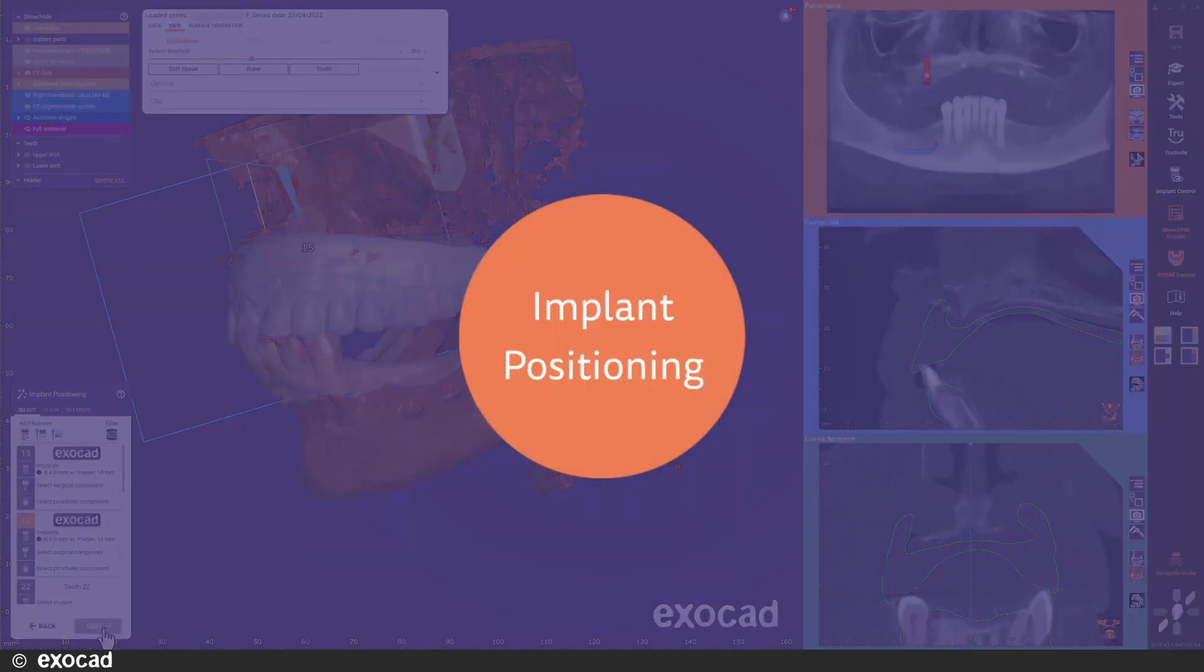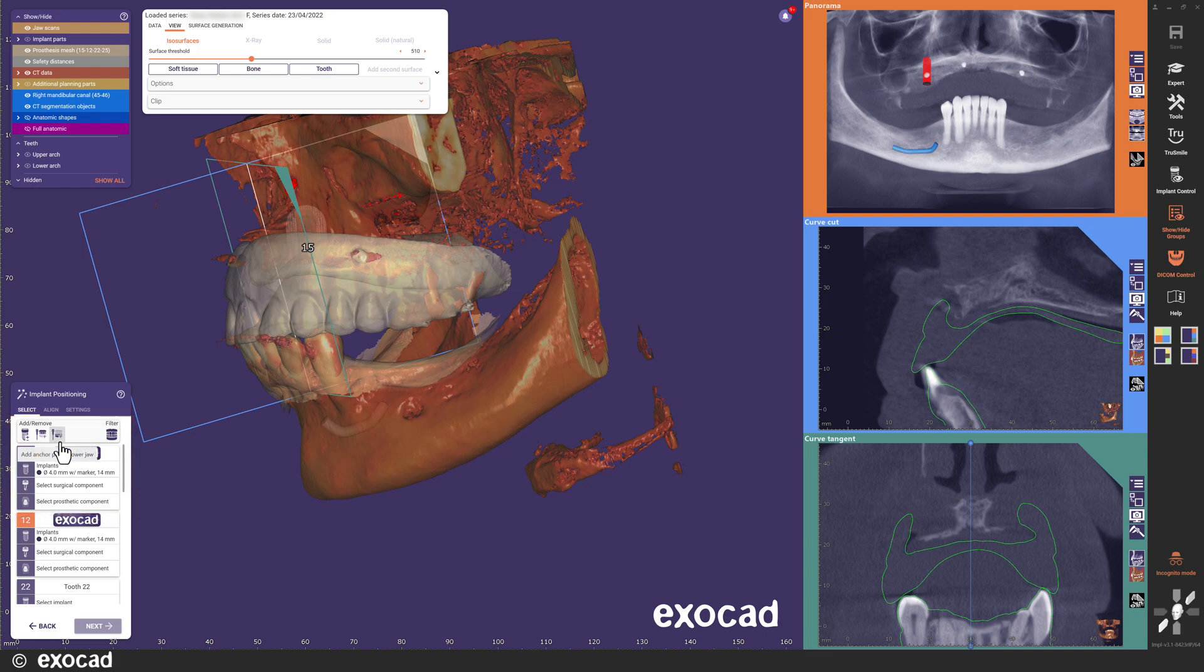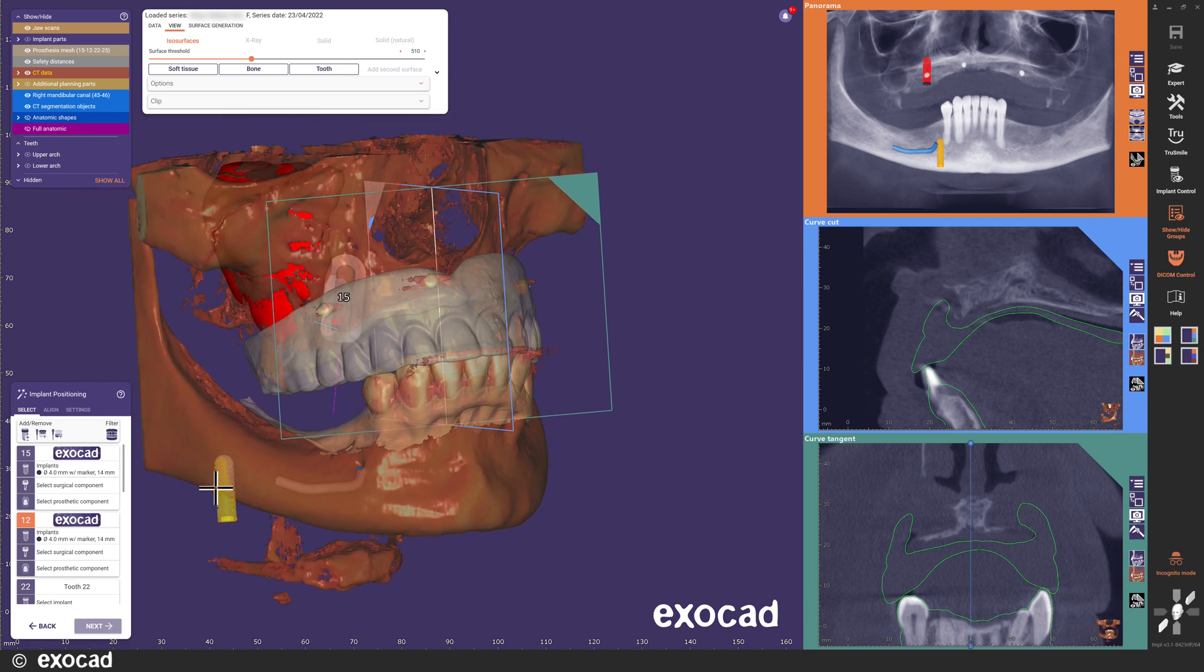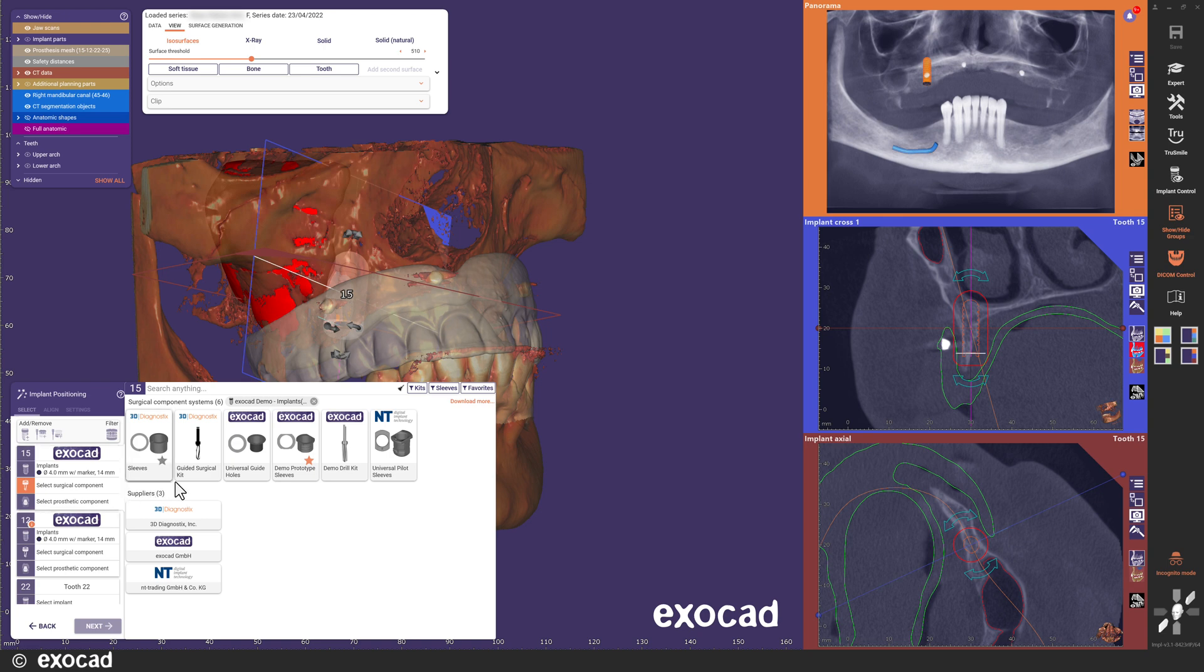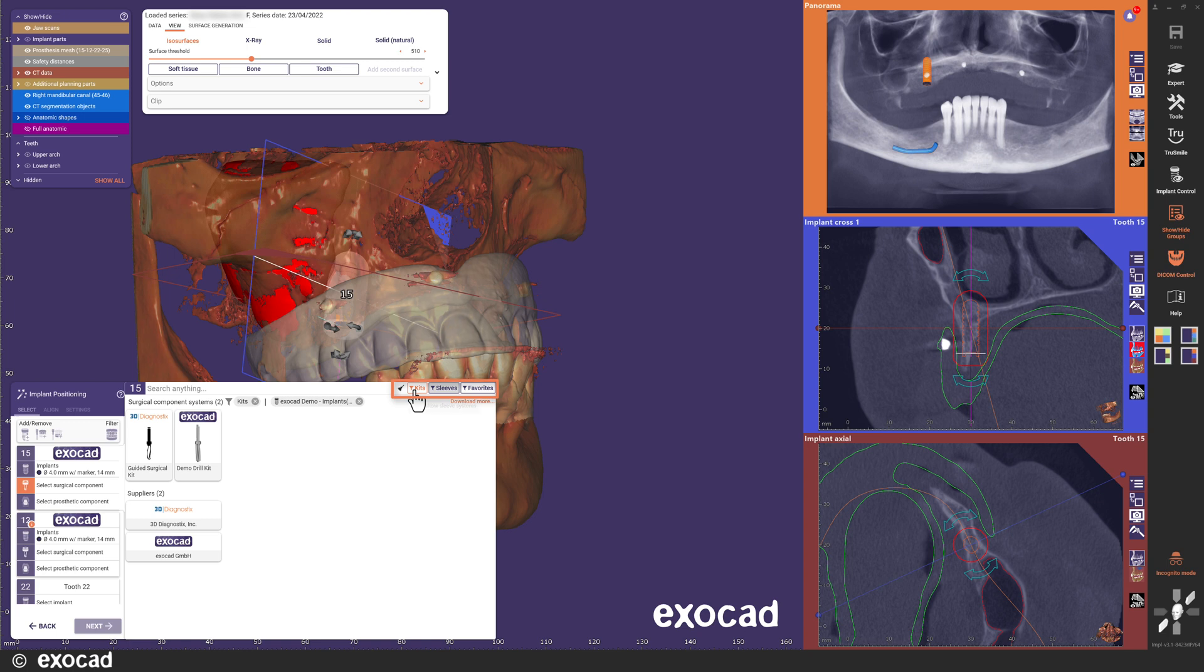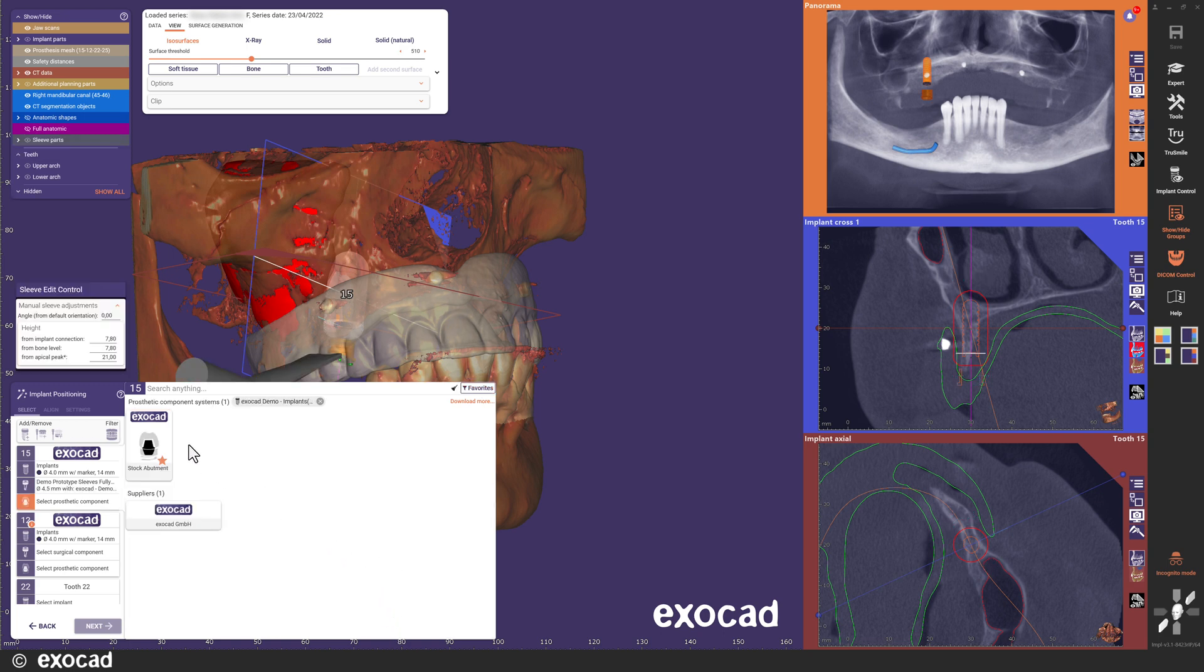Now we have arrived at the implant positioning step. One of our new key features in Rijeka 3.1 is that it's now possible to place both implants, prosthetic parts, sleeves and anchor pins within the same step. It doesn't matter if you select your implant, surgical component or prosthetic component first. When you have made your first selection and switch to another component type, the selection dialog will show you only compatible options from your installed libraries. As you can see, the implant I placed during the rapid preplanning is in the scene. And when I want to select my surgical component, sleeve and kit, only the options that are compatible to my implant are visible in the selection dialog. I can filter for different library types. For instance, here I can select to only show me sleeve libraries or only kit libraries. I can of course filter for my favorites. I will place the fully guided ExoDemo sleeve and the ExoDemo abutment.